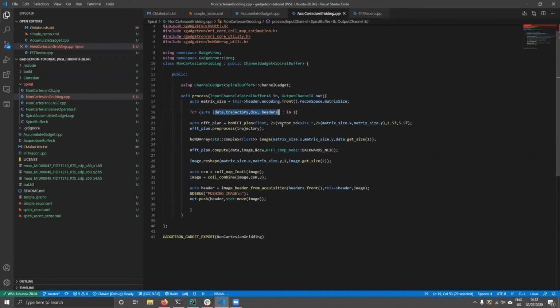We loop through our buffers. We create an NFFT plan, which is a non-uniform Fourier transform plan. It's working on floating points, in 2 dimensions. We tell it the 2-dimensional size, matrix X and Y. And then it needs an oversampling factor. 1.5 works pretty well. It needs a convolution size, 5.5. Again, if you don't give these parameters, it'll just use the defaults. And finally, we need to give it the trajectories, and it will pre-process. This pre-process essentially creates a giant sparse matrix for doing the NFFT.